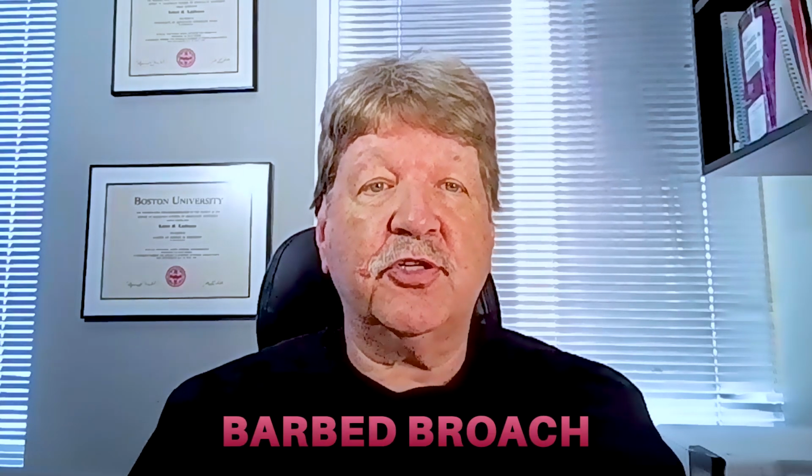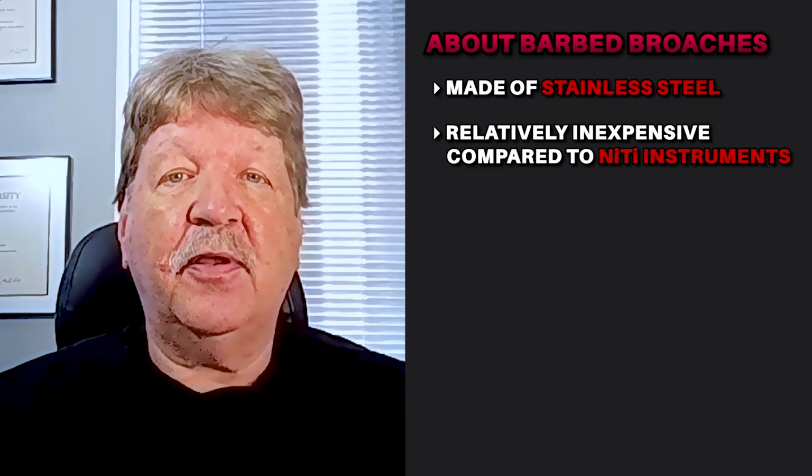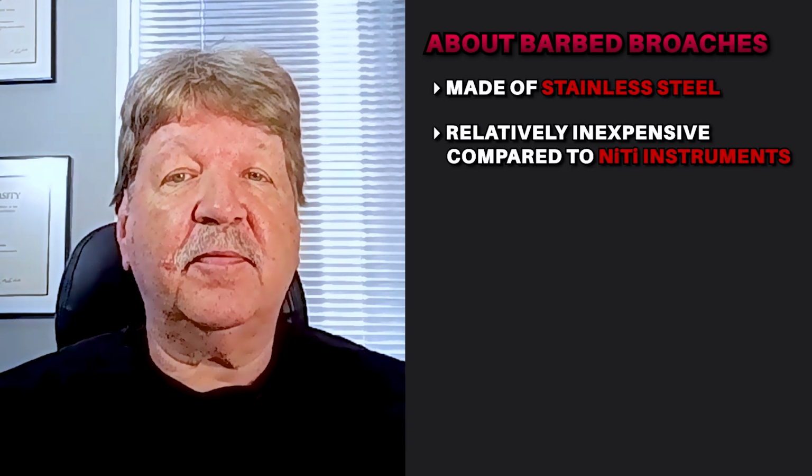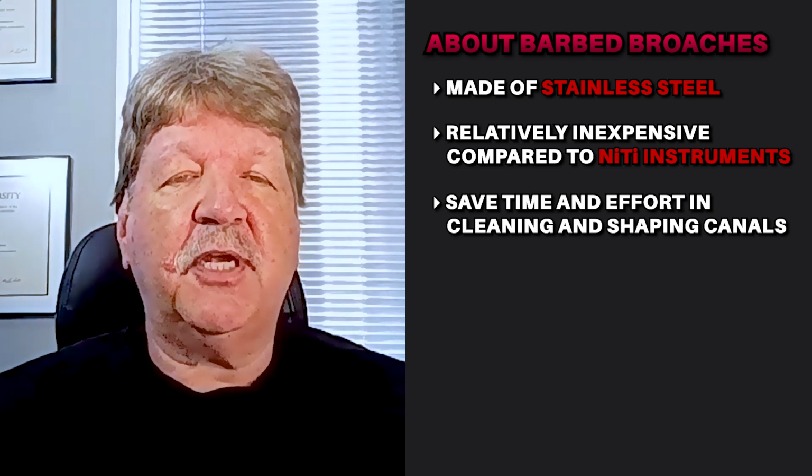The easiest and most efficient way to remove an intact pulp is by using a barbed broach. Broaches are made of stainless steel, and in comparison to NiTi files, they're relatively inexpensive. They can save you a great deal of time and effort when attempting to clean and shape canals.